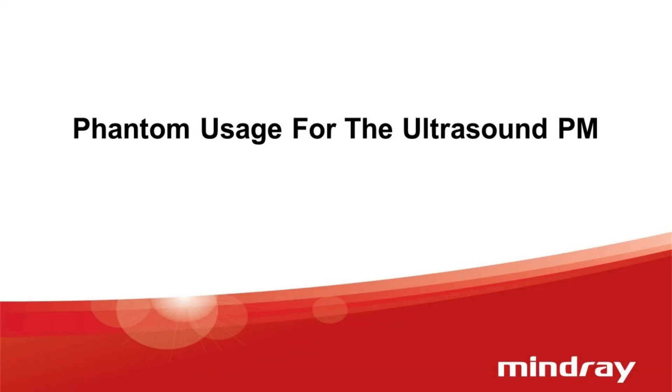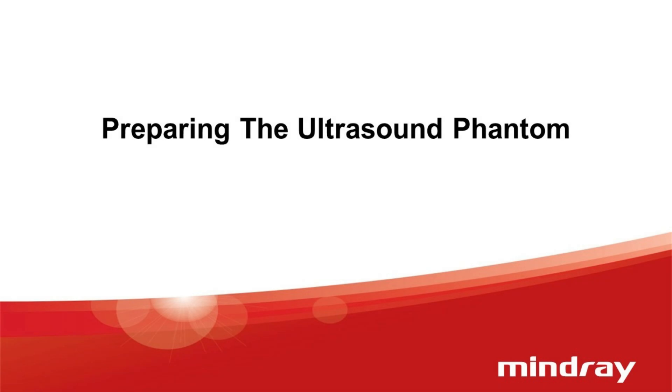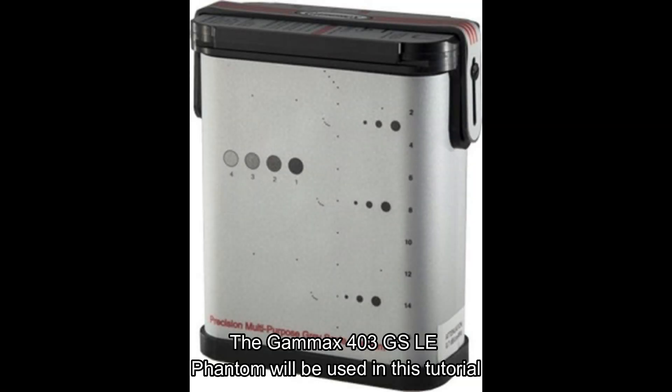Phantom usage for the ultrasound PM. Preparing the ultrasound phantom. The Gammex 403 GS LE phantom will be used in this tutorial.